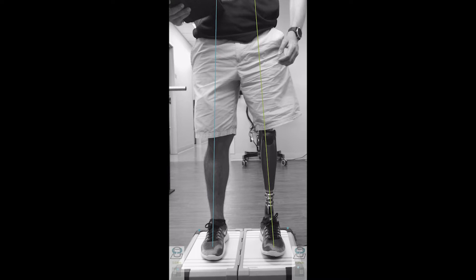Based on where the line falls in relation to the knee, it tells the practitioner whether the prosthetic foot — or prosthetic foot and knee — needs to either be brought under the patient or out from under the patient. The last thing to note in this view is what the lines are doing as they continue towards the trunk of the individual. The lines should draw closer to one another as we approach the patient's center of mass, but they should not cross one another.